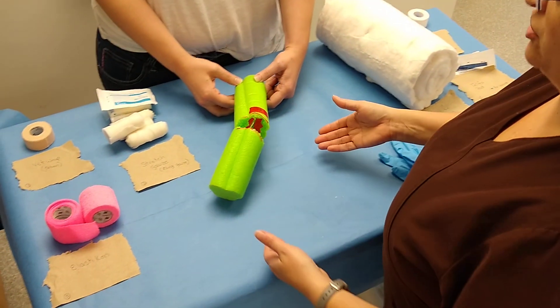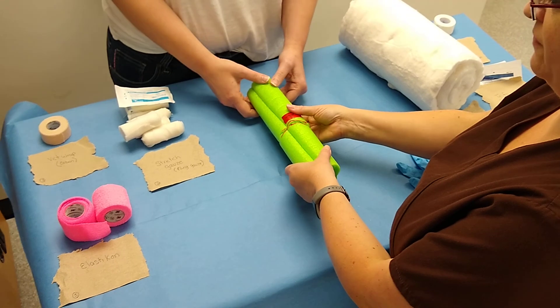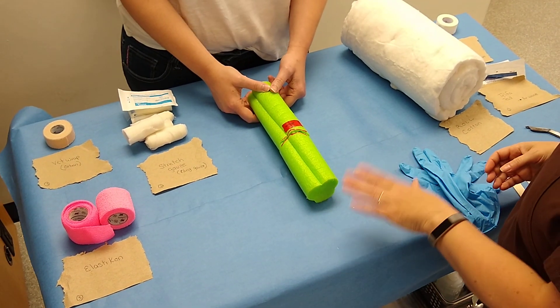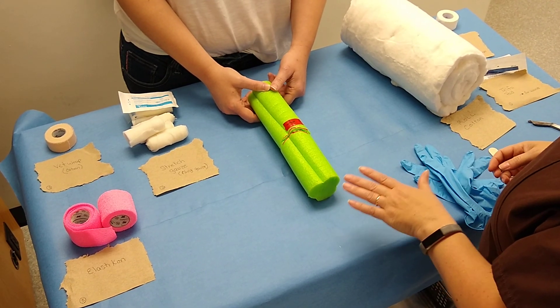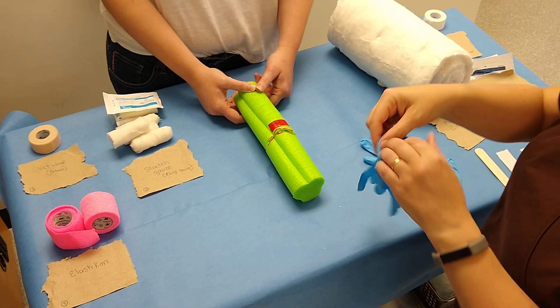There will be occasions where a patient might fracture their leg, hence the bone and the fracture, and you're unable to address the fracture right away. In those cases you're going to want to place a temporary bandage. That bandage is called a Robert Jones bandage. We're going to demonstrate that right now.